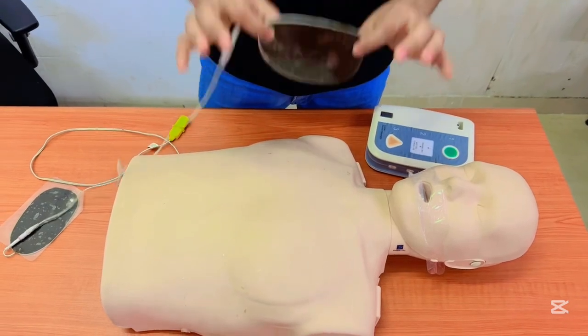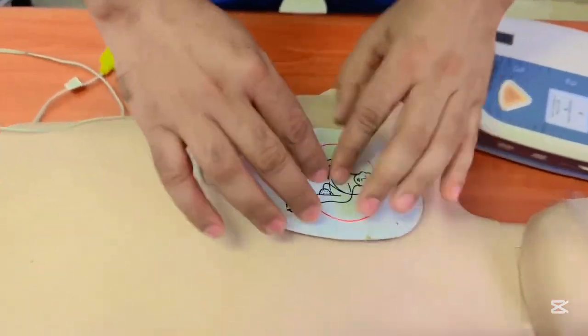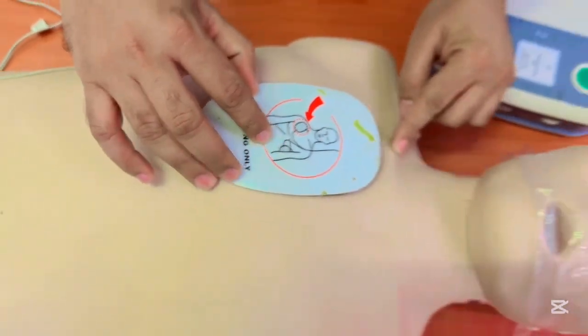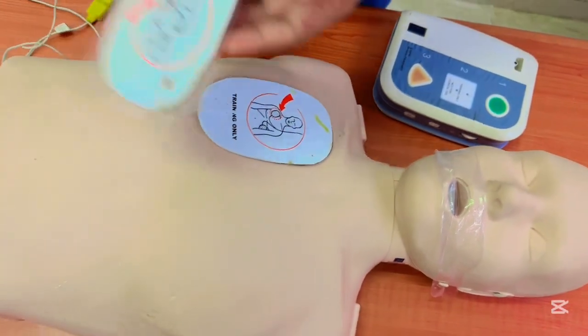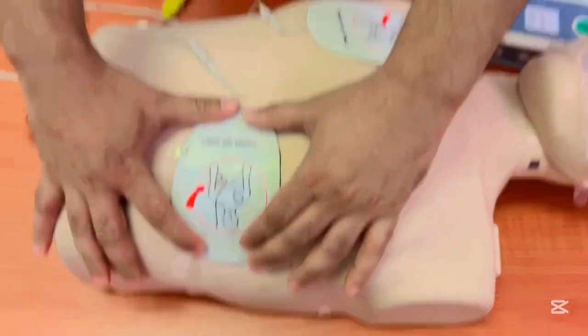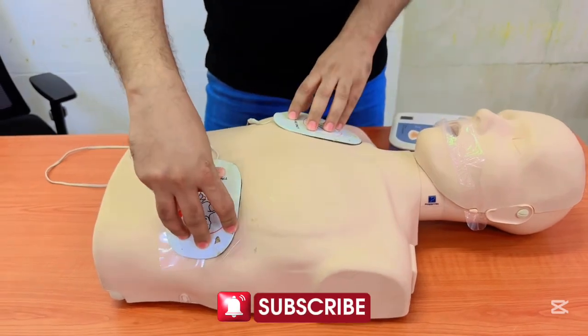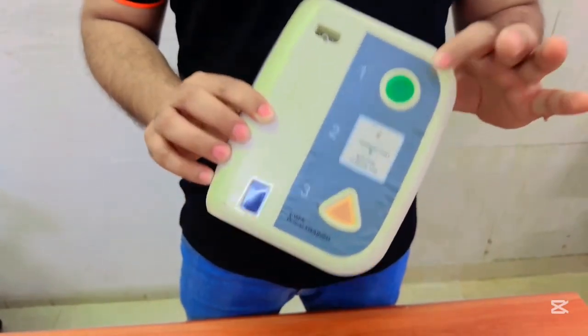Where do you have to place the pad? Under the collarbone on the right side. Instructions are also given on the pad as well. The second pad you have to apply as per the instructions given on the pad, on the lower left side of the chest of the affected person. You have to ensure that both pads are properly in contact with the body.